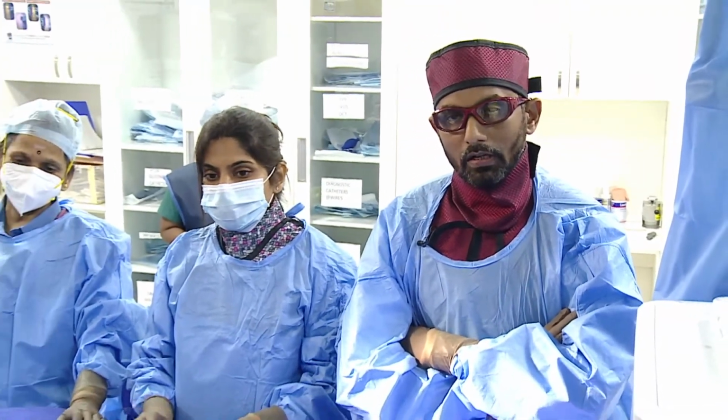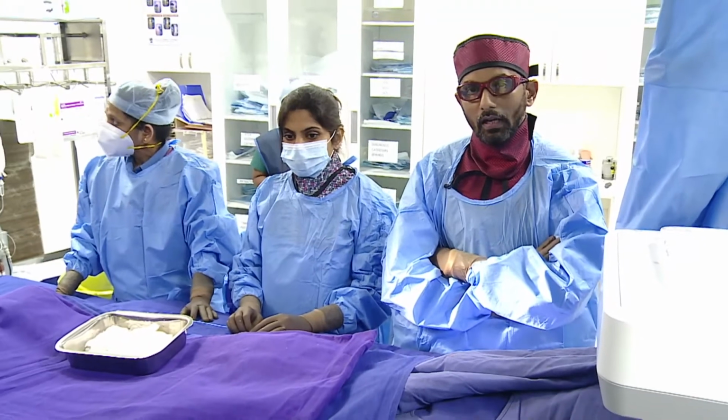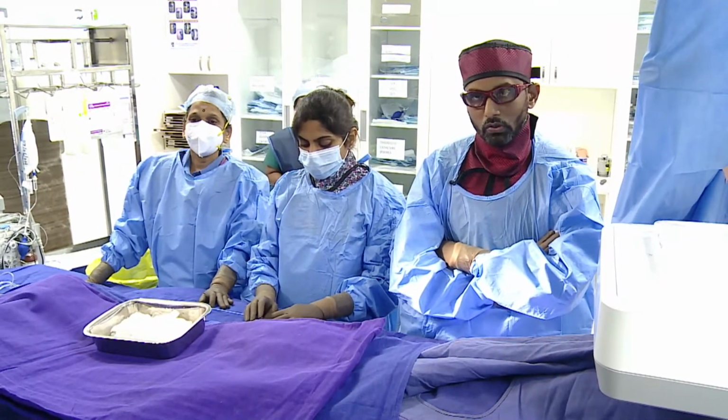So the idea today is to do an angioplasty of the proximal LAD, heavily calcified, with rotablation and deploy stents. So his LV function was nearly normal after thrombolysis, with his EF of around 55%. There were some regional wall motion abnormalities involving the LAD territory, but otherwise he's healthy. He's non-diabetic and he is hypertensive and he's on medicines for the blood pressure.